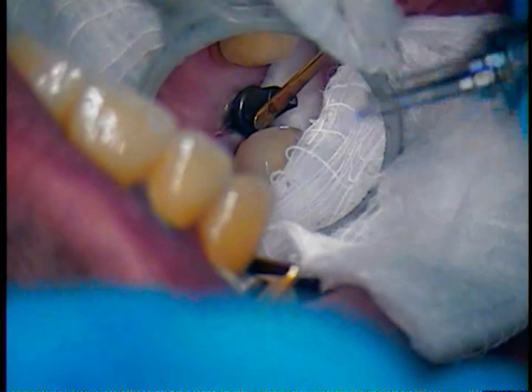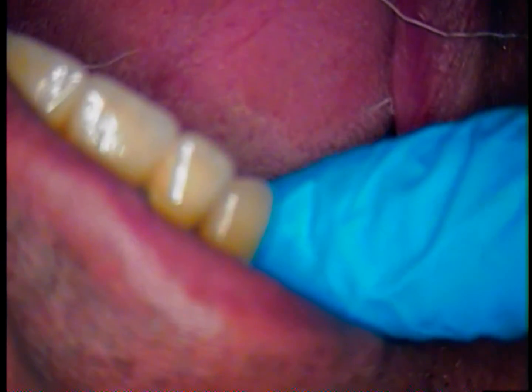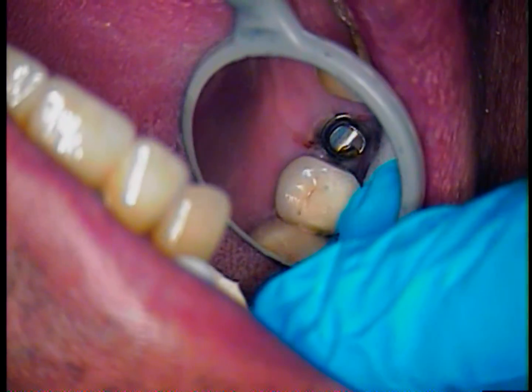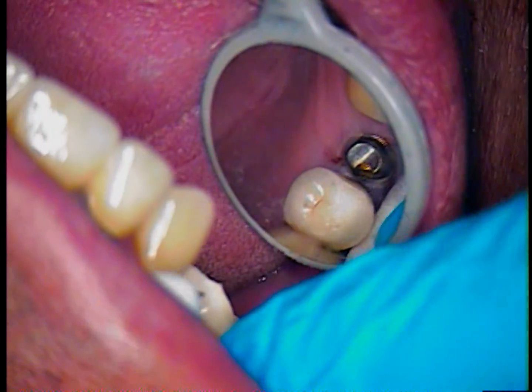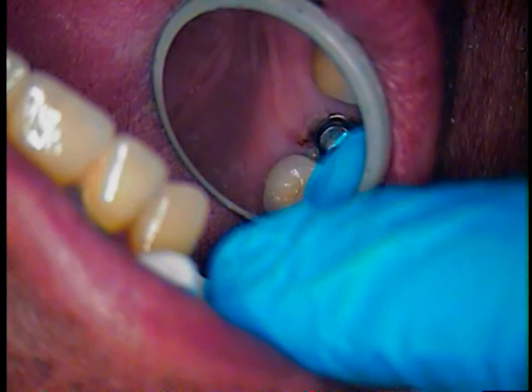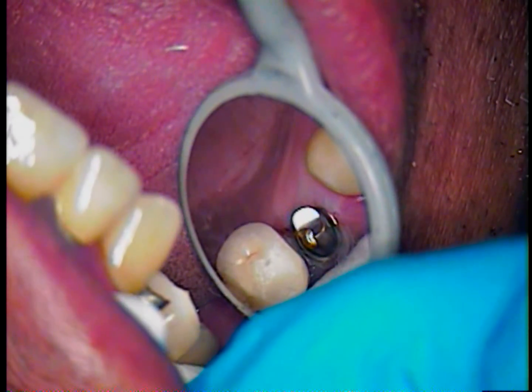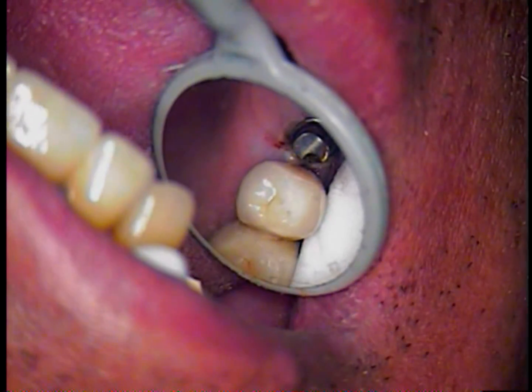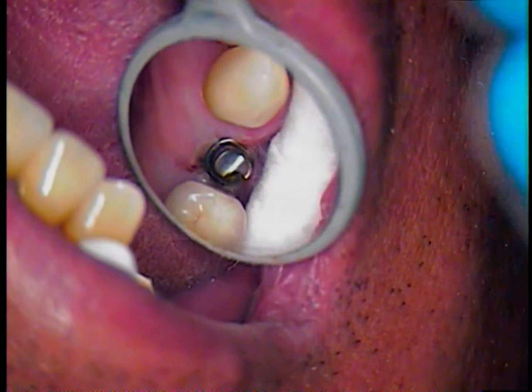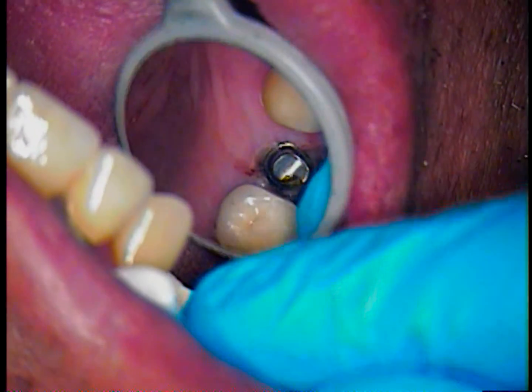This is platform switching, where the actual platform — where the abutment meets the fixture — has a little bit of a shelf for the gum tissue to roll into and create a seal. So the emergence profile has a better seal with the platform-switching type of implant. We see it in other companies as well, not only Biomet 3i. Here's the crown — you can see how tight it is, with very minimal space on the distal. I'm rechecking now just to make sure I'm in the right position.